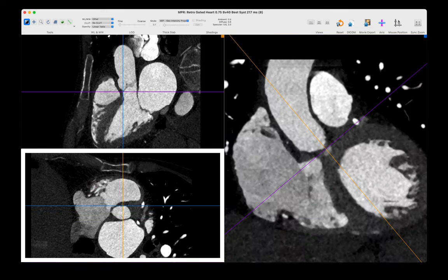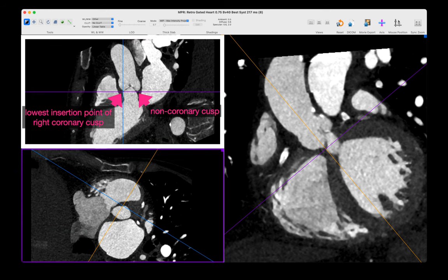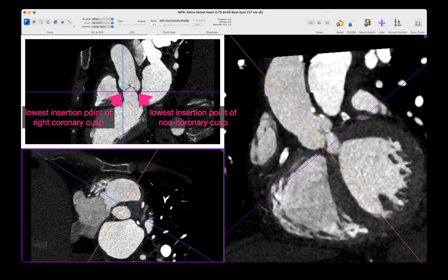You've now constrained your former axial plane to one of your three desired points. Rotate the crosshairs on your former axial view so that your former sagittal plane crosses the non-coronary cusp, which always points towards the interatrial septum at around the 8 o'clock position. Now look at your former sagittal plane — the crosshairs should intersect the lowest insertion point of the right coronary cusp and also somewhere near the lowest insertion point of the non-coronary cusp. Rotate the crosshairs on your former sagittal image so that it exactly crosses the insertion points of both the right coronary cusp and the non-coronary cusp.